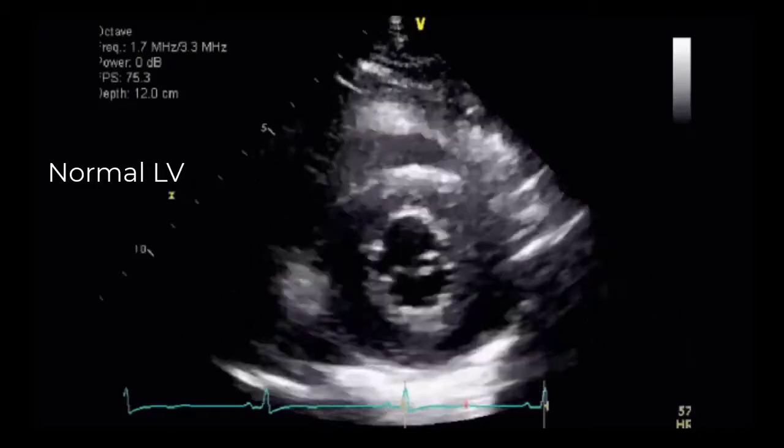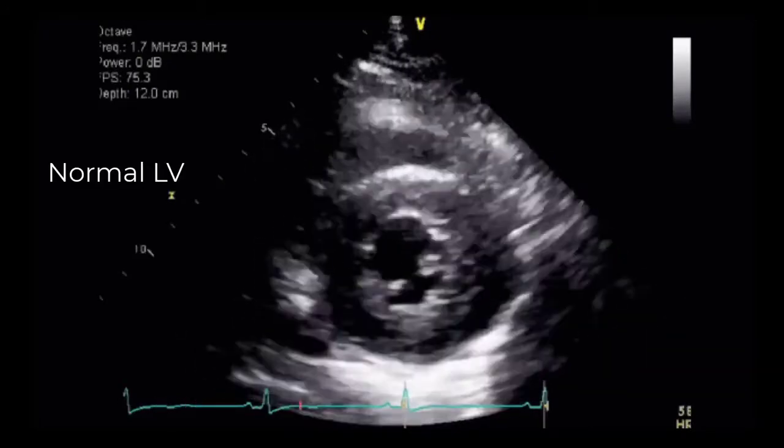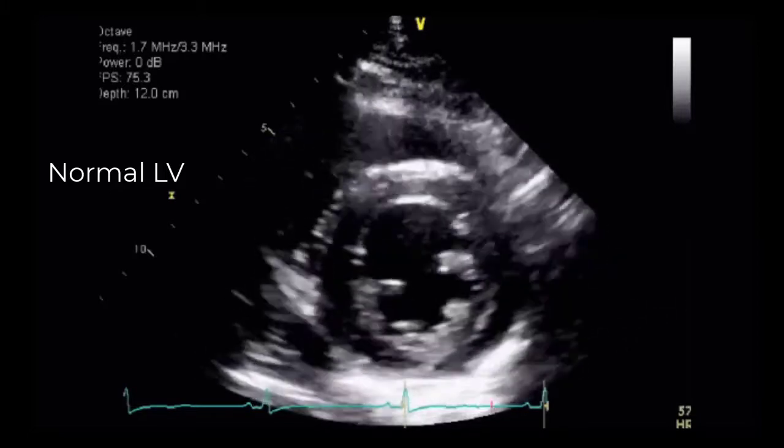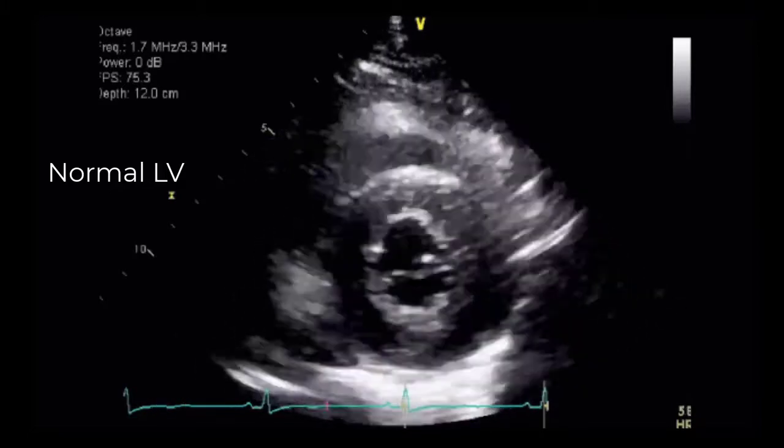We can now look at a few echo clips in the parasternal short axis view. Let's start with a normal left ventricle. The LV is seen here in the short axis. The papillary muscles are visible, making this a mid-parasternal short axis view. All four walls of the LV can be seen.